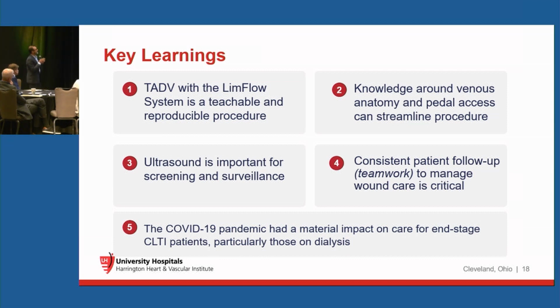There was significant knowledge that we learned around the venous anatomy, because I will show you this afternoon. We need to get lateral plantar vein access, and that's not something that we do. We are not used to doing that, and we just need to learn that. It's a small vein. You need to use the ultrasound. You need to become familiar, and so on and so forth, and we can discuss it this afternoon. Ultrasound is key. Without ultrasound, you cannot do this procedure.